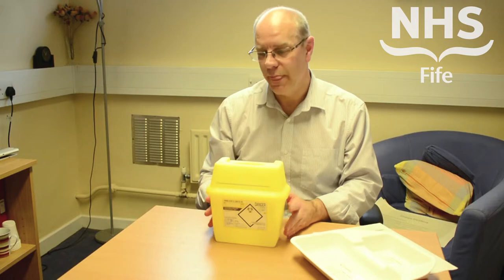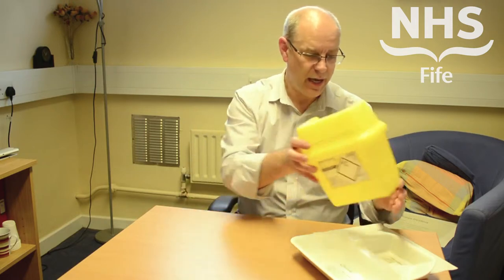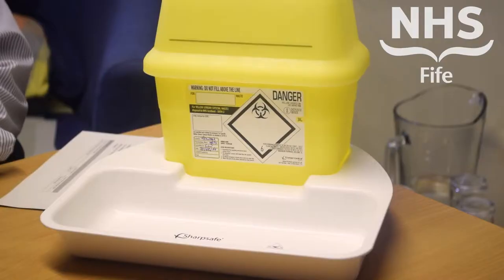We also want to make sure that sharps bins are used as close as possible to the point of use. We have this particular system with a tray, which is available to allow that to be used at the point of use with the patient, and there's somewhere to store your sharps and other items before they're used.